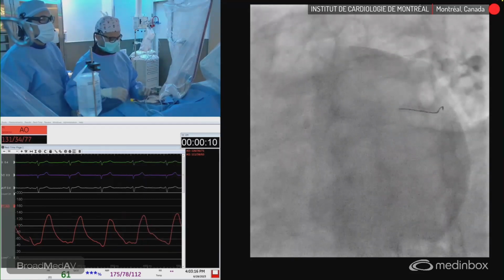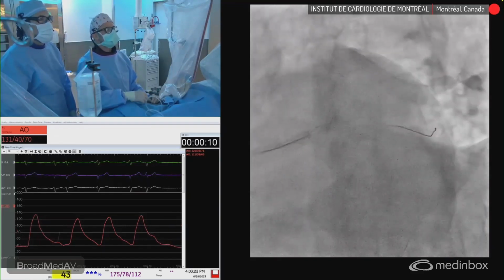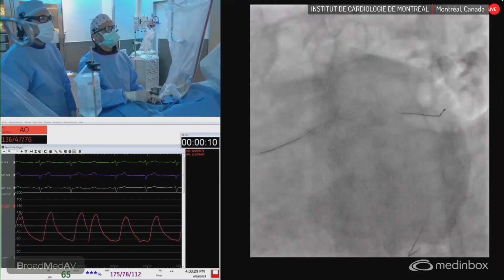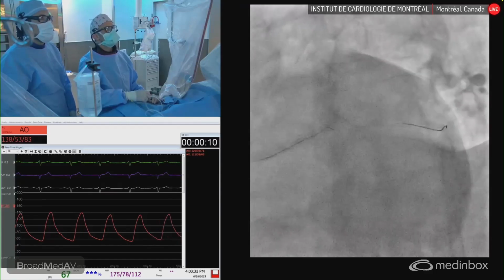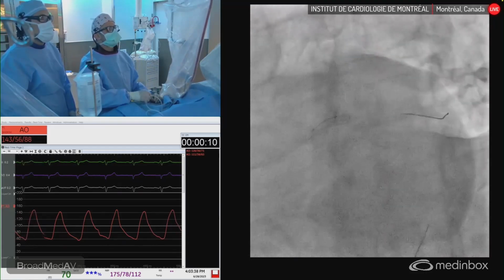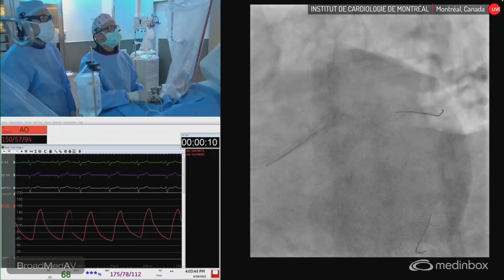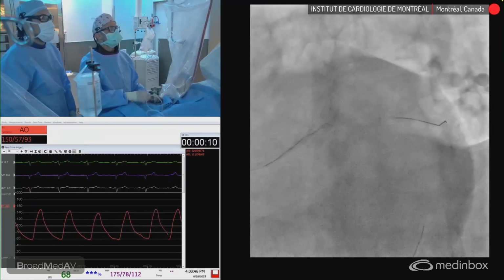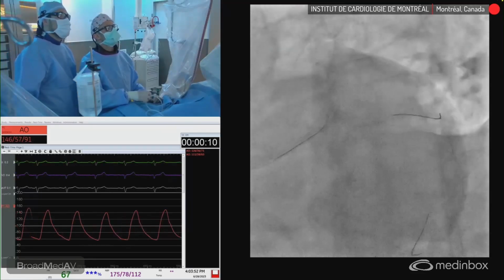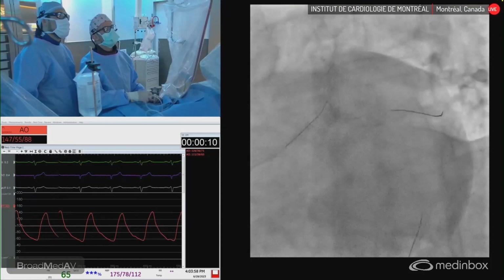Put a very big curve, and hopefully it goes through. This is the little branch. This is good. I'm inside the circ stent. Good. Yep, there. Slowly, because it keeps on doing a prolapse, but I think you're there.